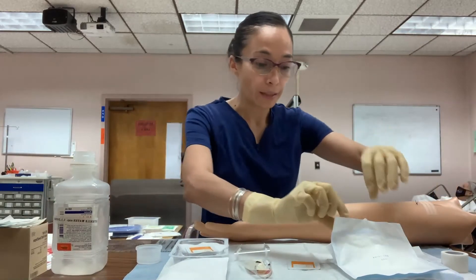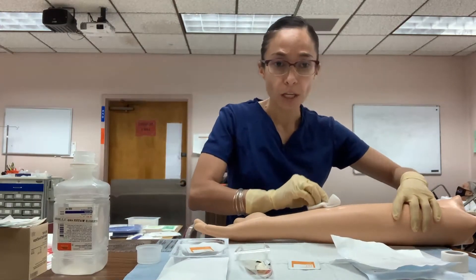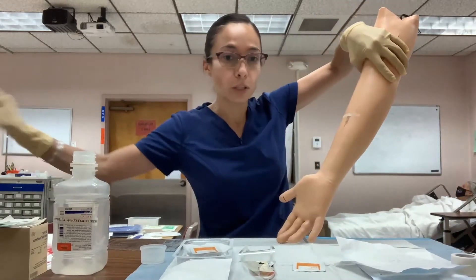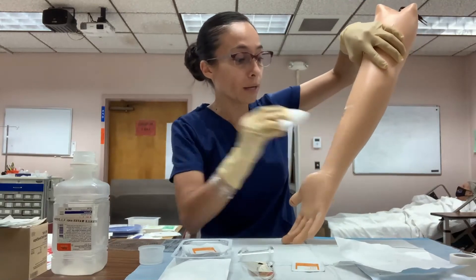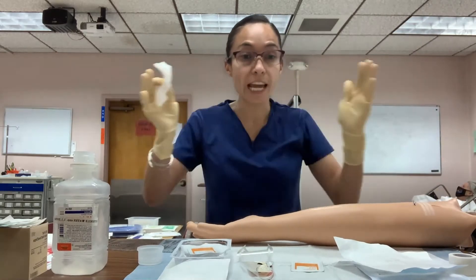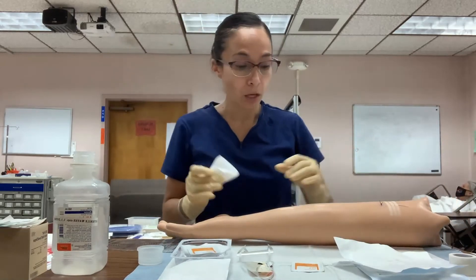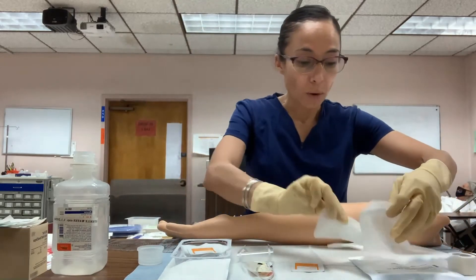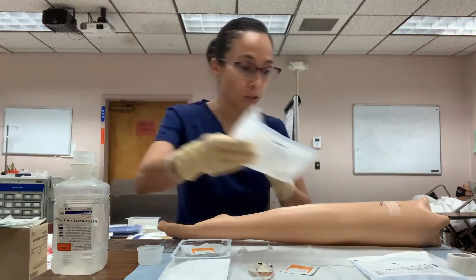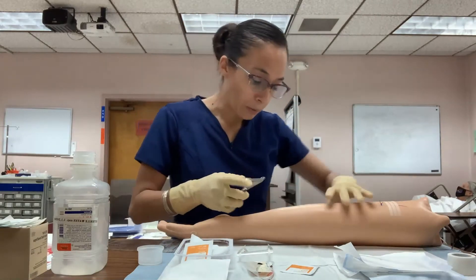Once you have finished cleaning, get a new piece of gauze and dry the wound using a patting motion — from the center outward. Use a separate piece of gauze for each pat and discard after use. Clean from center to outside in a top-to-bottom manner. Once the wound is clean and dry, you can proceed to remove the staples.